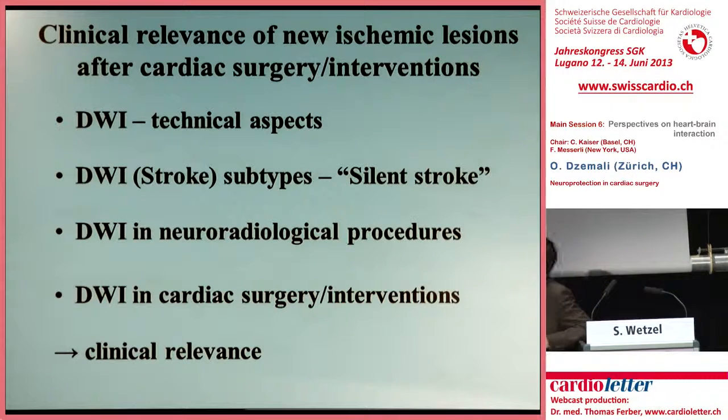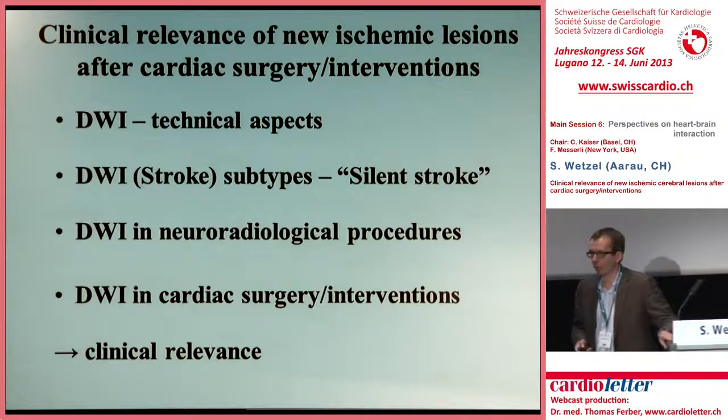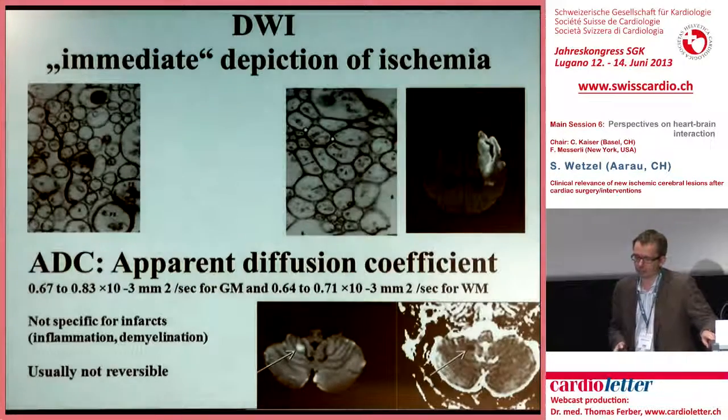Diffusion-weighted imaging. This technique allowed us to see new ischemic lesions without the need for a prior exam. I'll talk a little bit about the appearance of stroke on those images we acquire, the concept of silent stroke, and after a little detour to our field in neuroradiology, I will try to answer the question of the clinical relevance in the cardiac field.